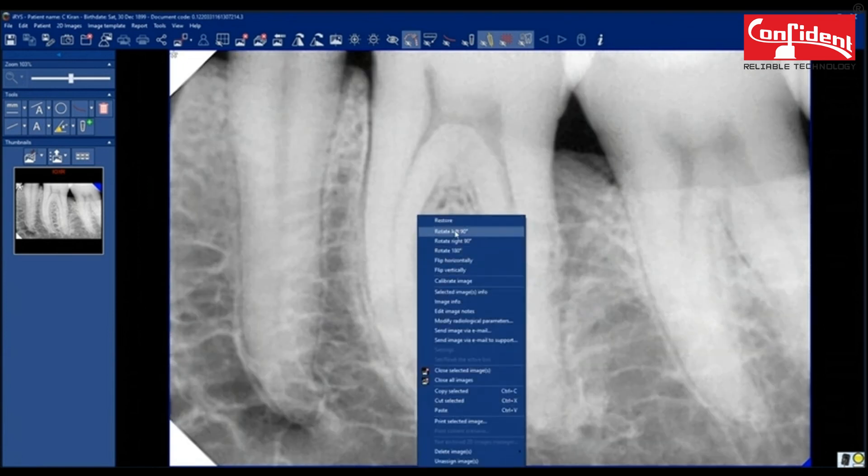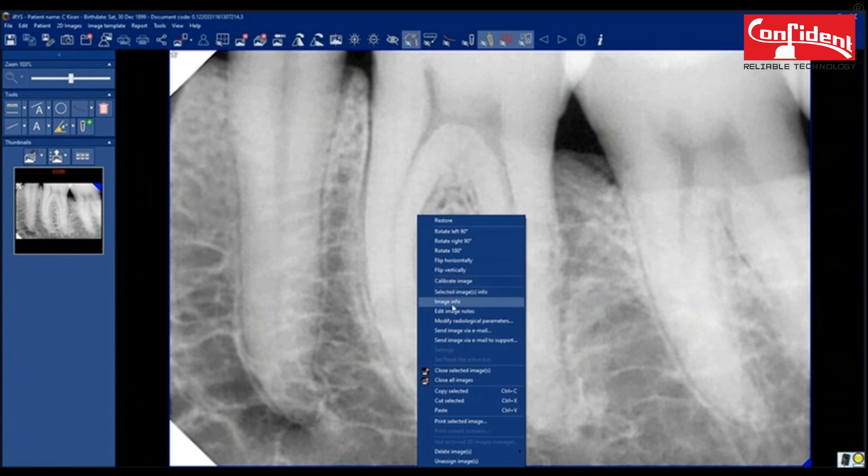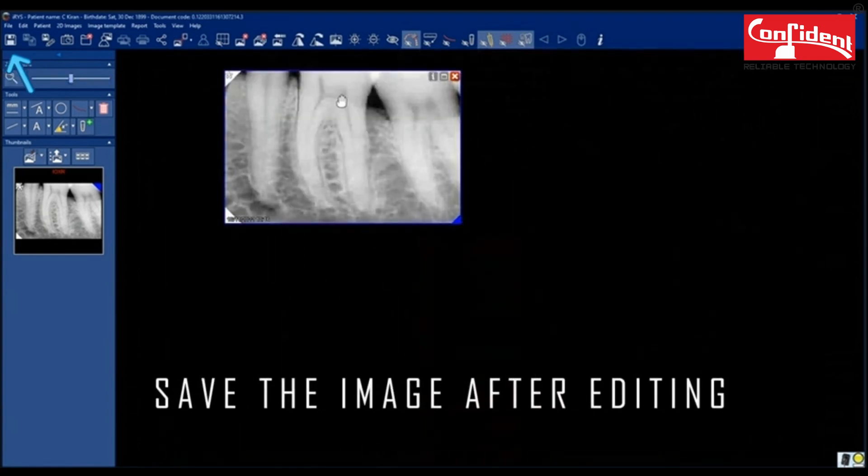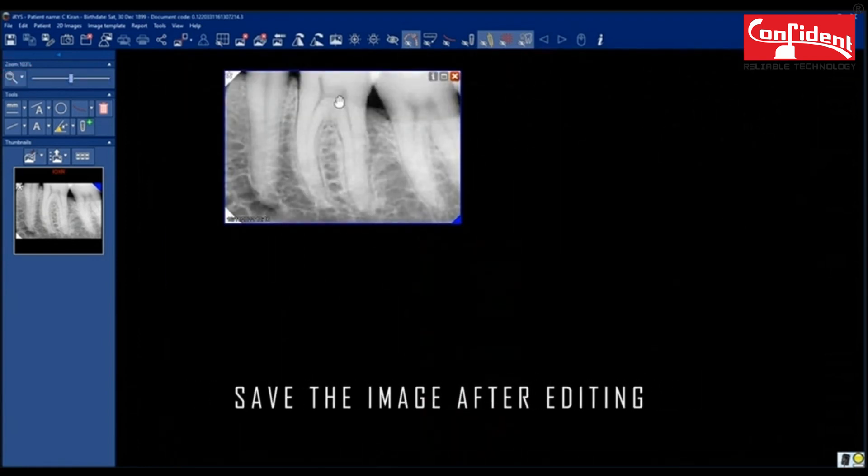When you right-click on the image, you will find the image editing tools here as well. Save the image after editing.